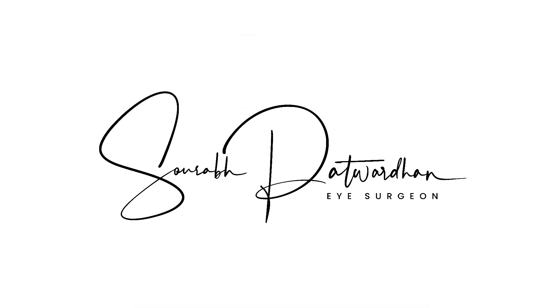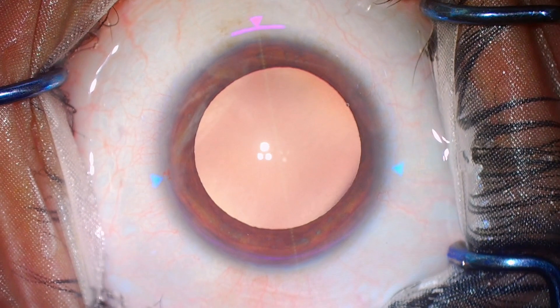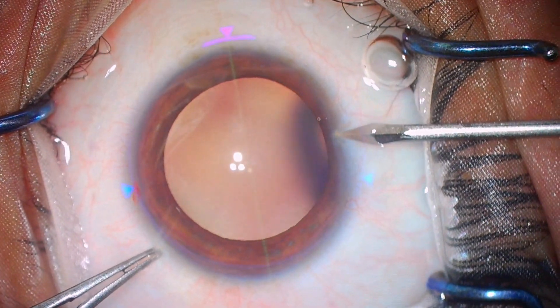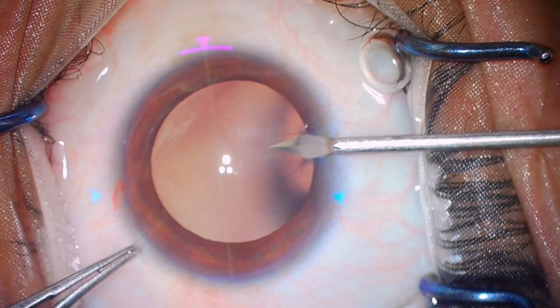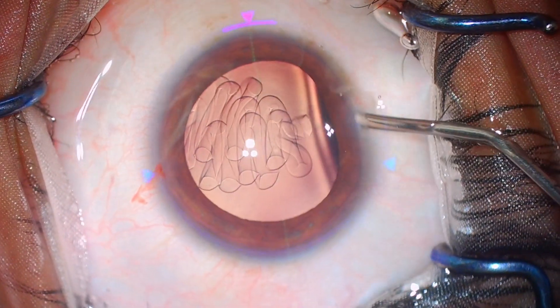In this video, I will be showing a couple of cases where I have to exchange the IPCL. This is an IPCL by Care Group India. It is an amazing IPCL that I have been using for the past 9 years — almost more than 800 implants — with very predictable results. It is a very good alternative for those who cannot undergo corneal refractive surgery.